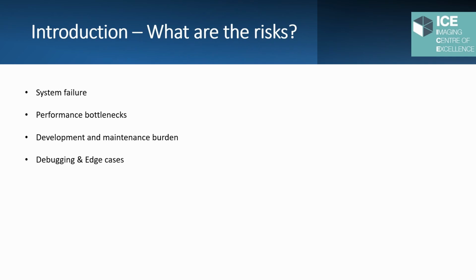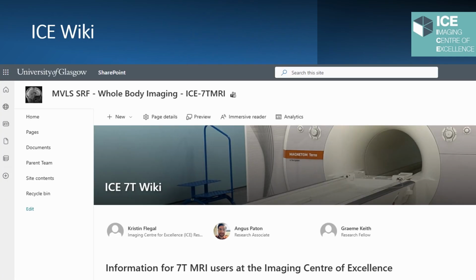As I have built these Docker containers, I have purposely made every effort to mitigate cases where image processing can fail. There will be edge cases that I have not considered, but again, as these problems arise, that threshold for failure will become smaller and smaller, and the benefit will be for the whole community. All of the functions on Compute-XNAT will be supported with documentation and video tutorials that will be available on our ICE wiki. This is currently in the process of being populated.